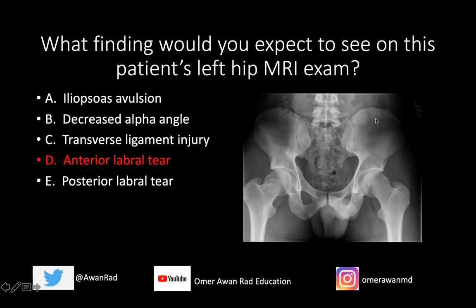This is a nice example of what CAM type femoral acetabular impingement would look like. If we take a look here closely at the left hip, notice that at the femoral head and neck junction, there's a bump or an osseous protuberance at the femoral head and neck junction, which is suggestive of the CAM type of femoral acetabular impingement.